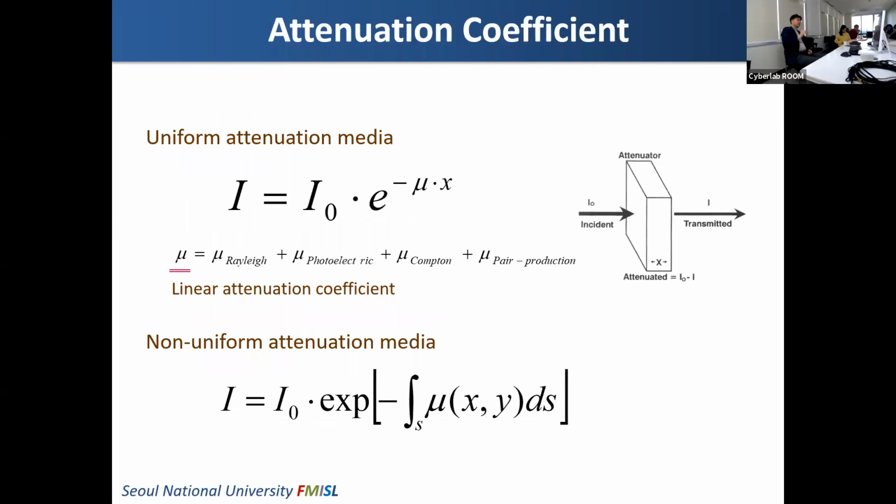To understand attenuation, we should be familiar with this equation, which is very popular in nuclear medicine. This equation describes how radiation and gamma rays are attenuated by attenuating materials.